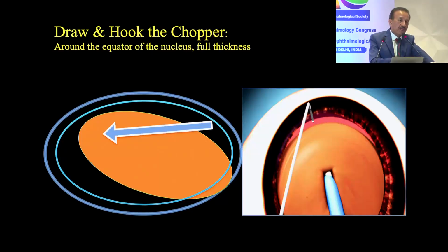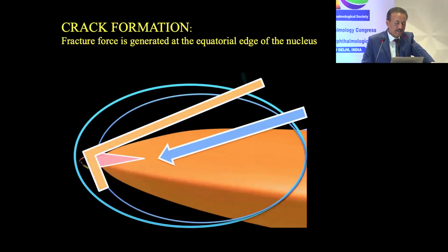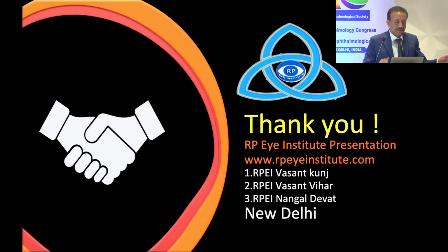Here you don't go blindly. You have to draw the nucleus and see the edge, then only hook it. After seeing the nucleus, then hook it. This is what is happening, and then the crack happens at the equator, and this crack goes to the periphery, and you get a complete cracking.